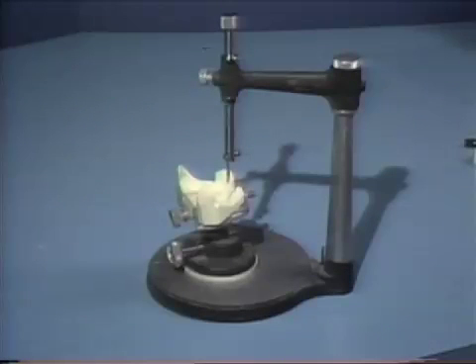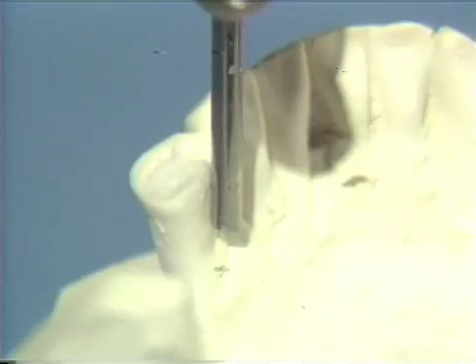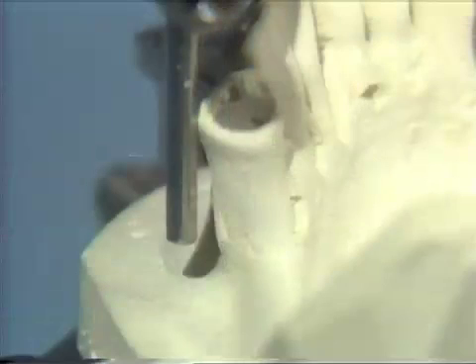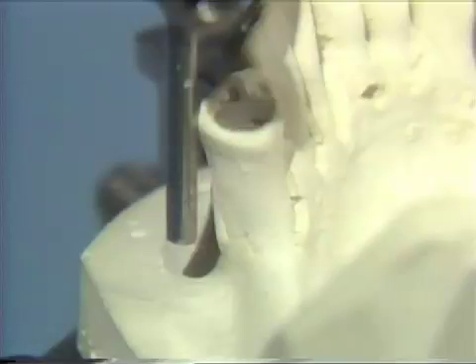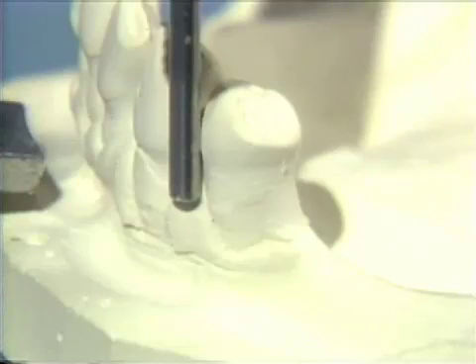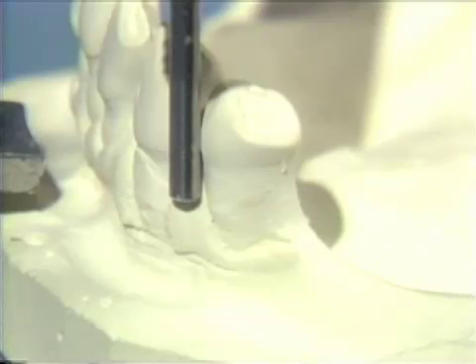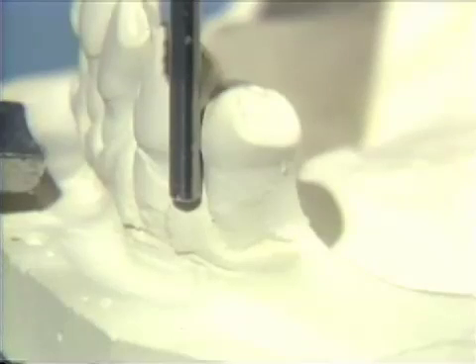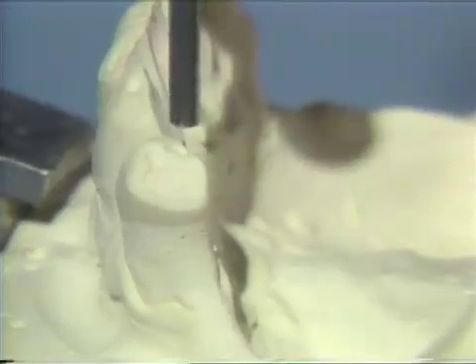Diagnostic casts are examined on the surveyor to analyze the contours. The mesial lingual of tooth number 21 gives a suitable guideline and will be left intact. The distal buccal undercut on tooth number 21 is undesirable for clasp placement and will be reduced. The mesial buccal of tooth number 21 lacks sufficient undercut for retention; the retention will be increased with composite. The corroded amalgam will be replaced as part of this procedure, and a mesial occlusal rest will be placed in the natural tooth structure of tooth number 21.